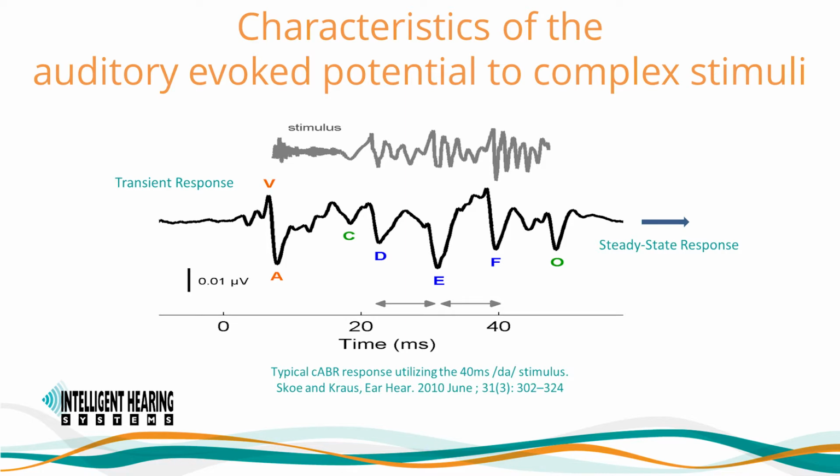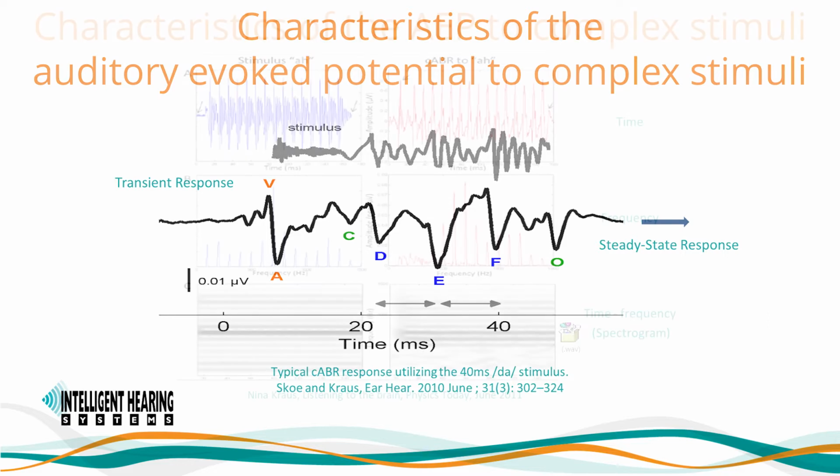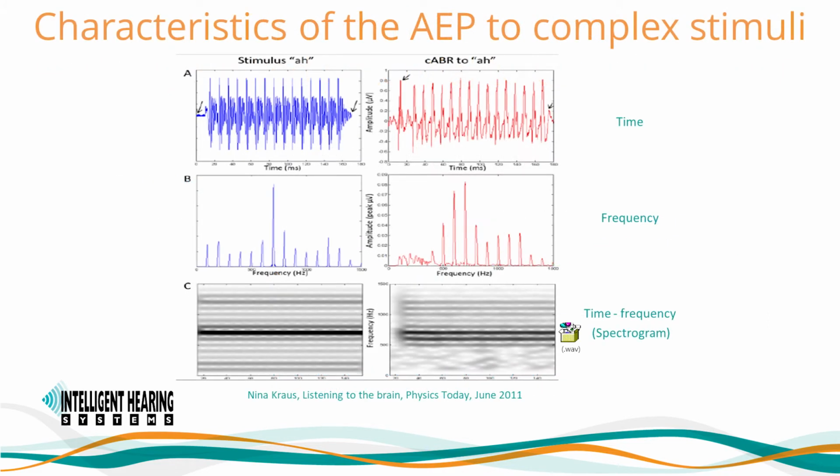The vowel portion of the stimuli, especially in the longer duration speech syllables, will produce a steady-state response that follows the transient and sustained responses. The FFR response reflects the acoustical characteristics of the stimulus used to acquire the response. The fidelity of the response to stimulus relationship is high in brains that can process the stimulus precisely.